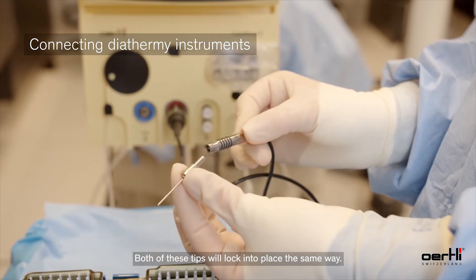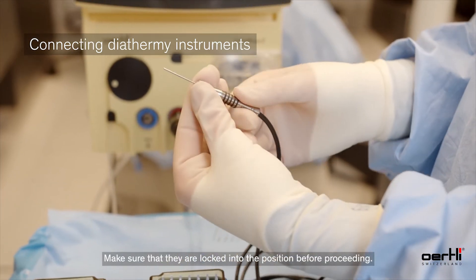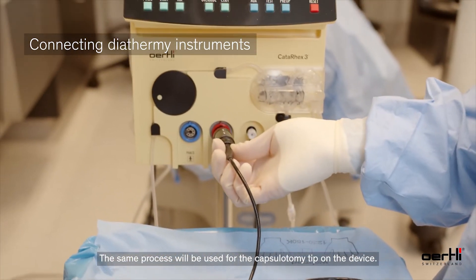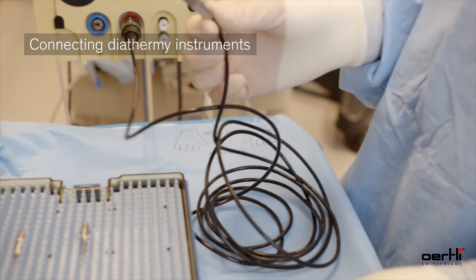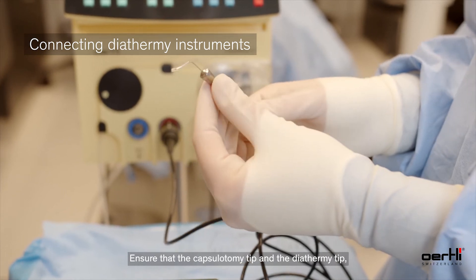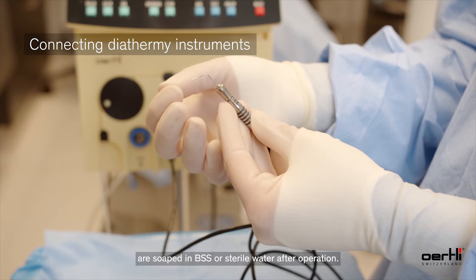Both of these tips will lock into place the same way. Make sure that they are locked into position before proceeding. The same process will be used for the capsulotomy tip on the device. Ensure that the capsulotomy tip and the diathermy tip are soaked in BSS or sterile water after operation.